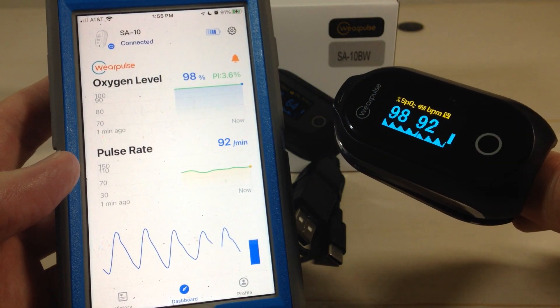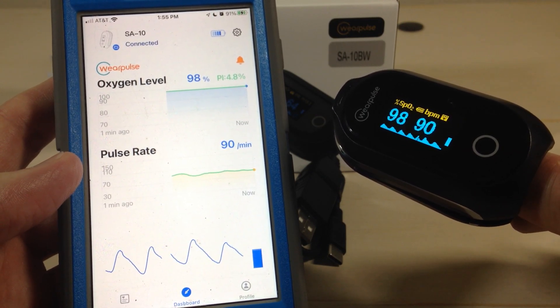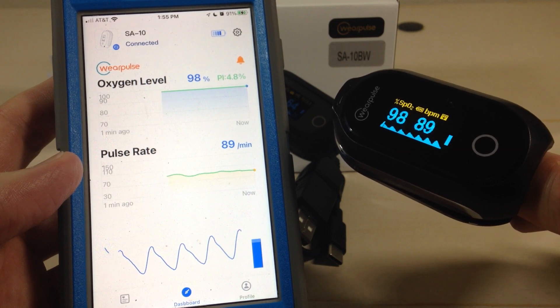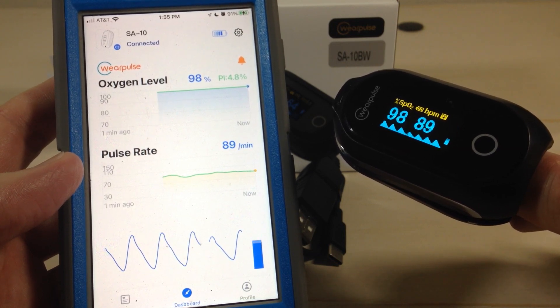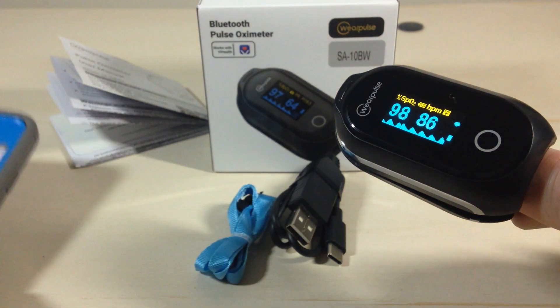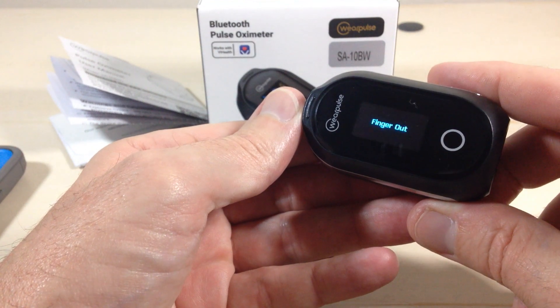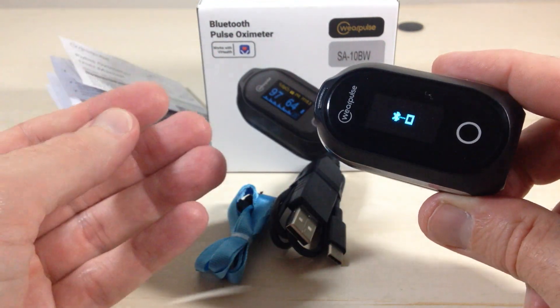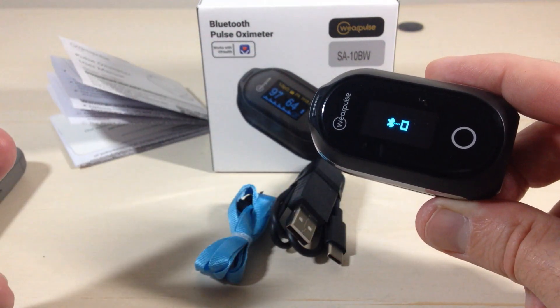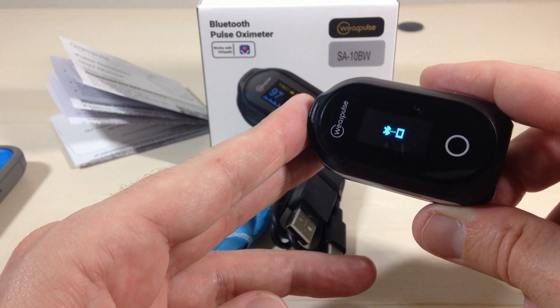Hopefully you can see that. I'm going to let it sit here and read for a few seconds. Once you're done taking a reading, simply take it off. If you've got the Bluetooth connection, it'll send the information over to your app. And in about two minutes, the device will cut off automatically.